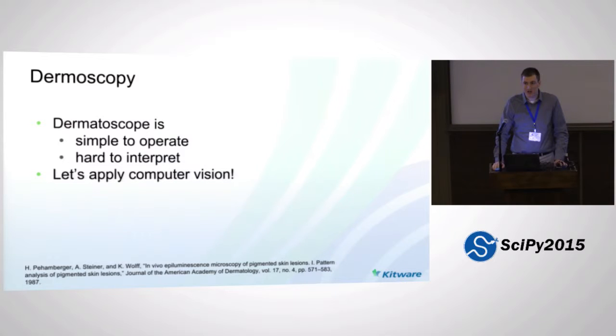It doesn't require a trained dermatologist to operate the camera, but the actual interpretation of the images is very difficult. And there really is not a lot of consensus in the medical field about how to even interpret images. There are various schools of thought. There are various competing textbooks. In fact, I'll show you in a little bit a list of all the various competing terms that they have to use. So this is an area which really is ripe for computer vision to come in.